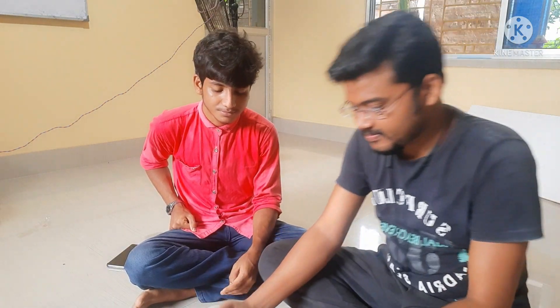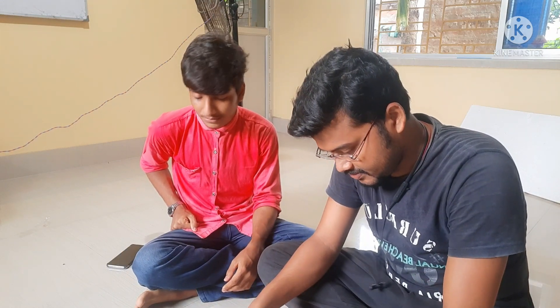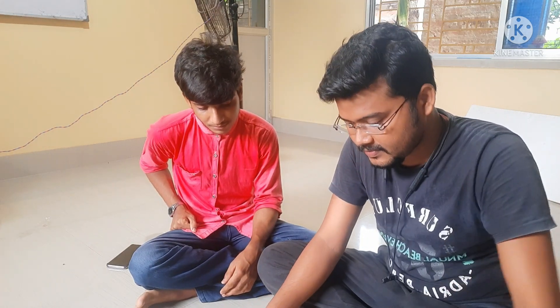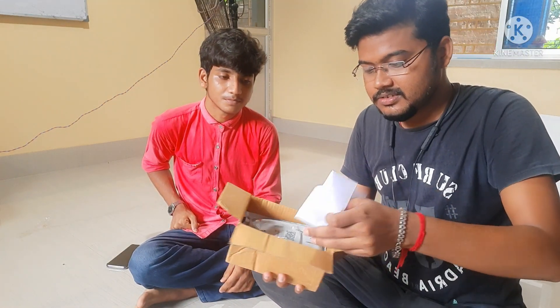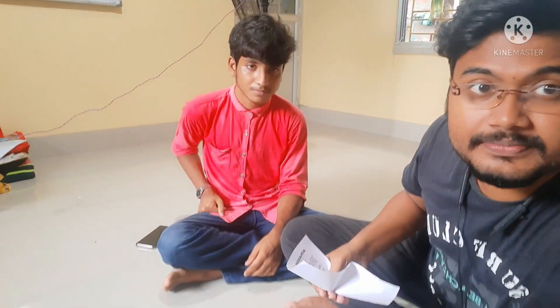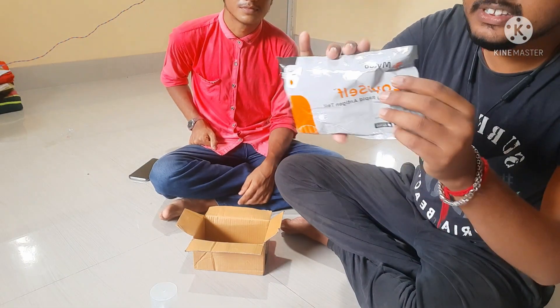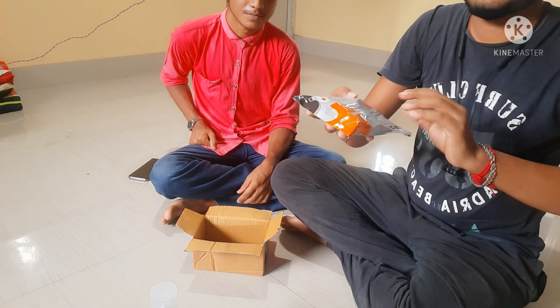It's time for unboxing. Let me cut the wrapping above the box. We have opened the box. The box contains a bill payment receipt from Amazon, which you can see here. Inside the box is the main item: the Kovi self-test kit.